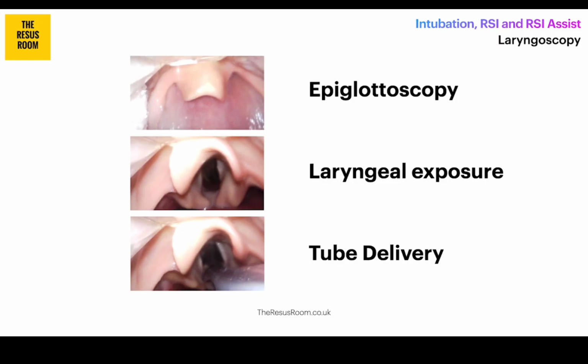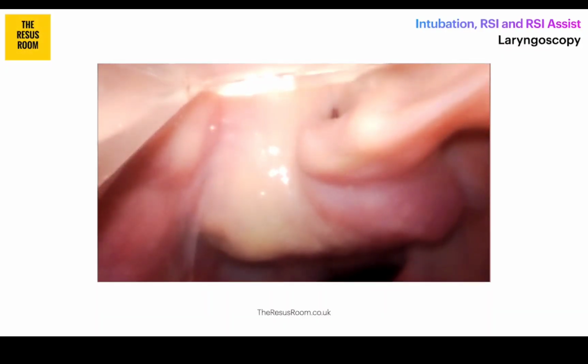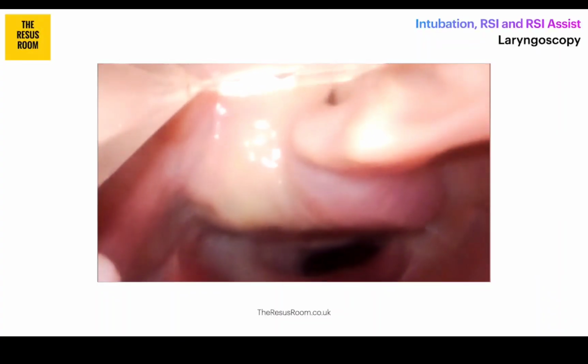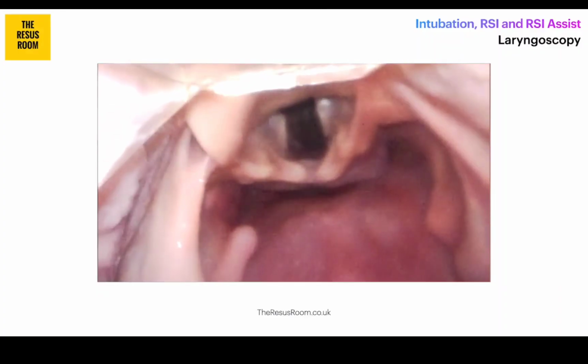Now, this is really useful because it splits up this skill into really small parts that help you slow down the process and keep orientated to these more simple steps. When you watch clinicians practice their technique in the cadaver lab or intubating on real cases, both pre and in hospital, it's really rare to see people intubate too slowly. The process is normally too fast, and when this happens, orientation to where they are is lost, and this can really hype up the stress of the situation, and then the escalating loss of orientation eventually leads to an unsuccessful attempt at intubation. And this is why breaking down the process into these 3 steps really helps slow it down and achieve what you're trying to do.